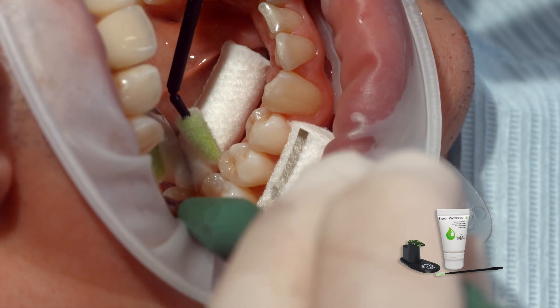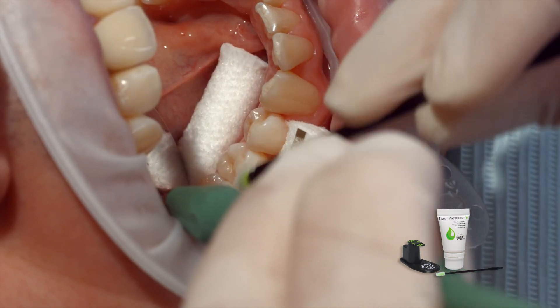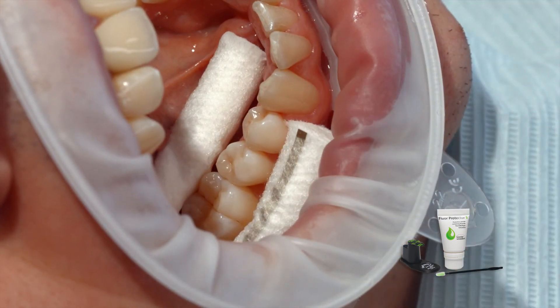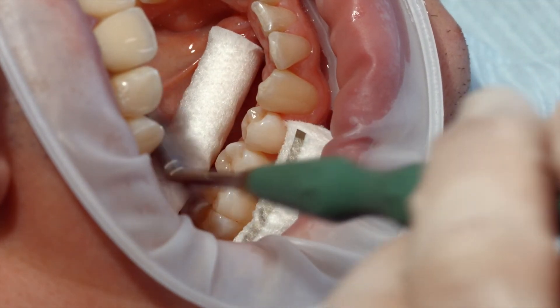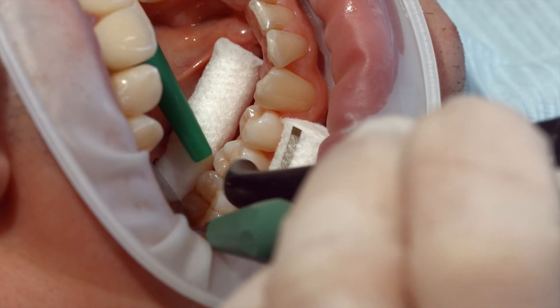As a final step, apply a thin layer of Floor Protector S using a Viva brush or a conventional brush. Use the air syringe to disperse and dry the varnish.